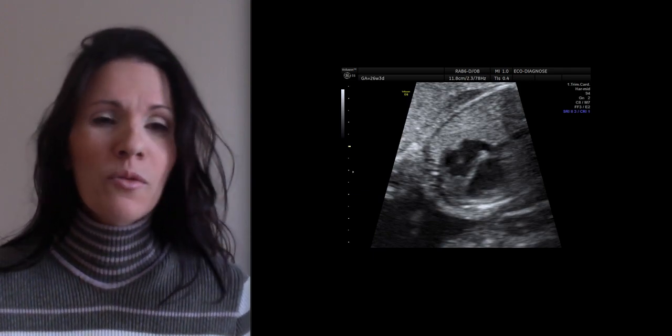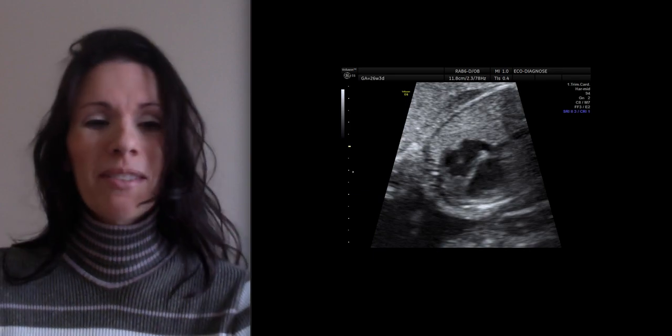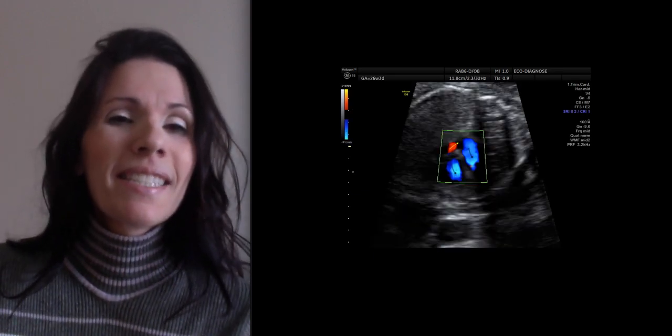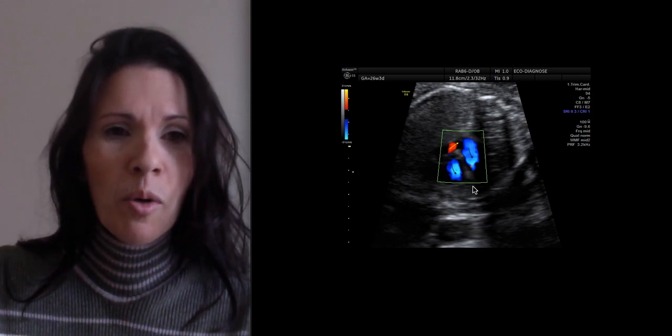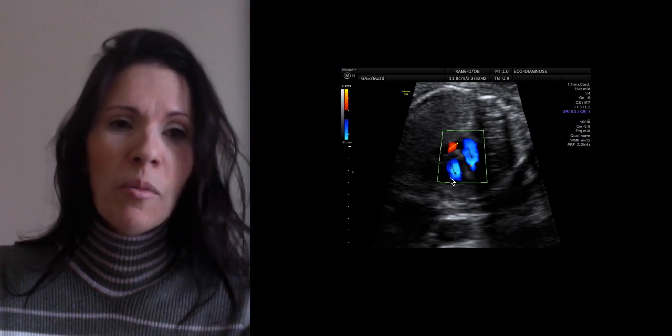I got the mitral valve and tricuspid valve open, and the integrity of the septum is here. But to be sure, let's see the color Doppler. You see here, this is the normal left chambers, and this is the normal right chambers.